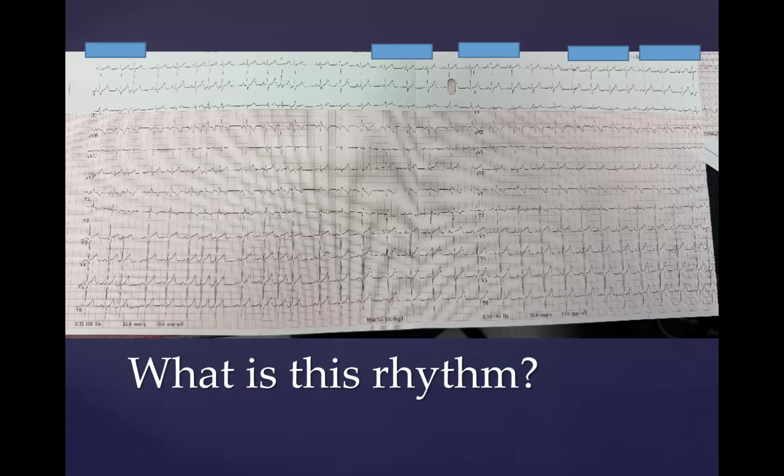Maybe only one of you has ever seen us pull a cryo catheter in the entire last 3 years that you're fellows. There are lots of reasons. It's technically challenging to integrate it into the Carto system, and we have to physically bring the console from another room, and the cabling is very short. There are like 100 reasons we don't love cryo. But one of the main reasons is that the catheter is very difficult to manipulate and it's very stiff.